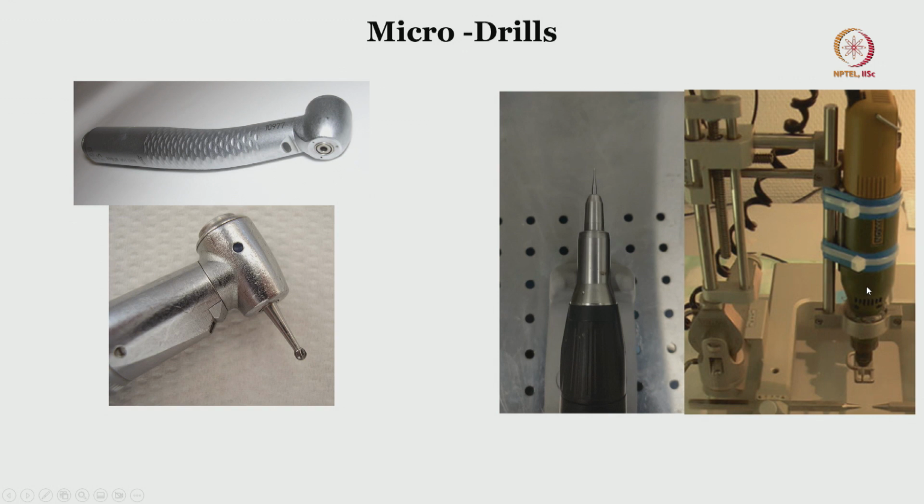To use this particular system, you need to make sure that the head is fixed rigidly without any dorsoventral, that is up and down, movement of the skull. Because if that happens, then there is a sudden plunge when the bone is drilled and the extradural space is reached.